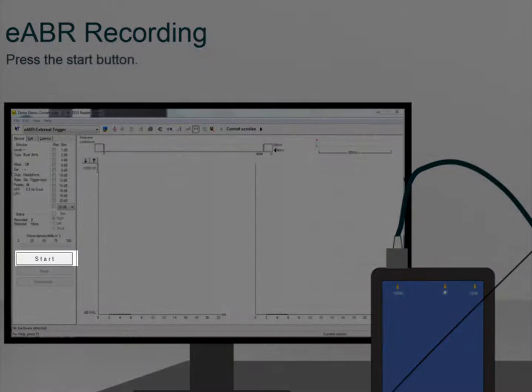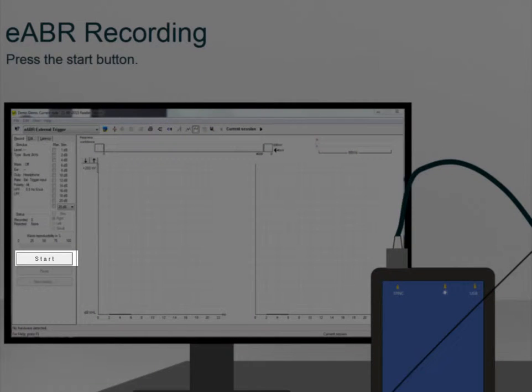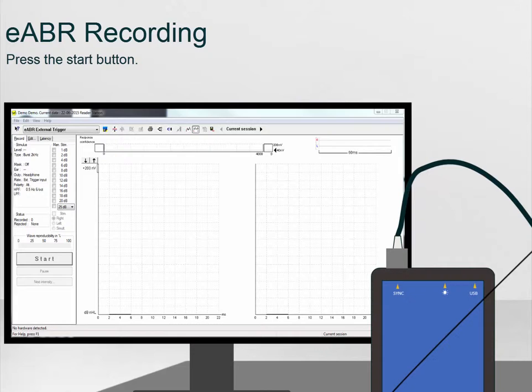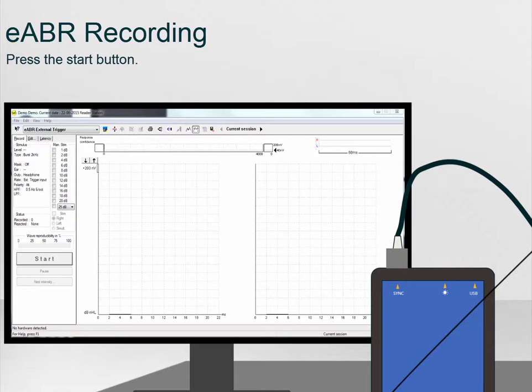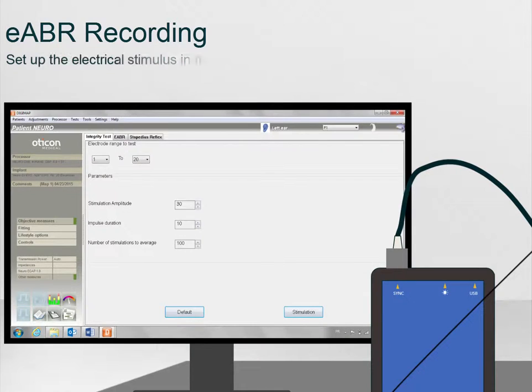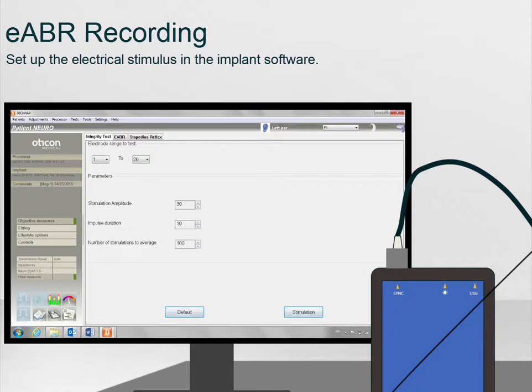When ready, press the Start button. The Eclipse will wait for the implant software to send the trigger signal before recording begins. Follow the instructions provided by the implant manufacturer to start sending the trigger signal to the Eclipse and the electrical stimuli to the patient.